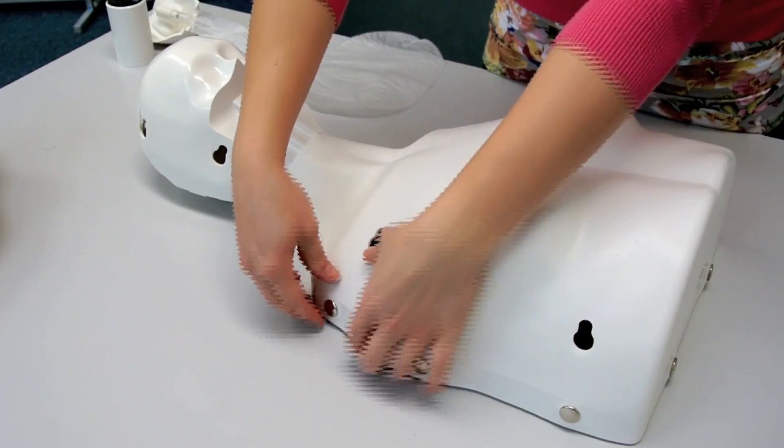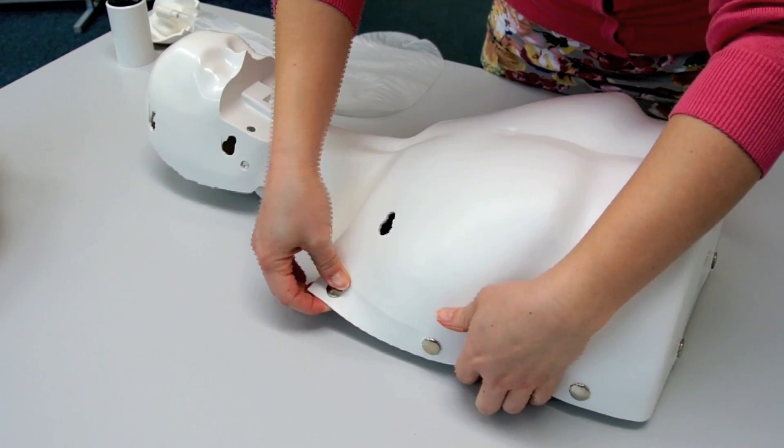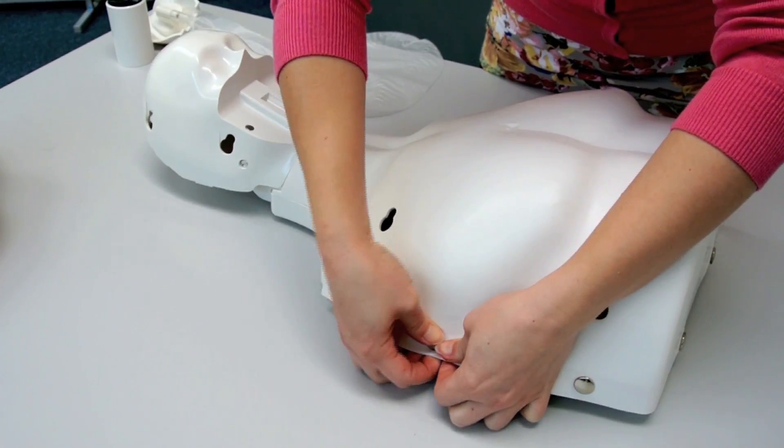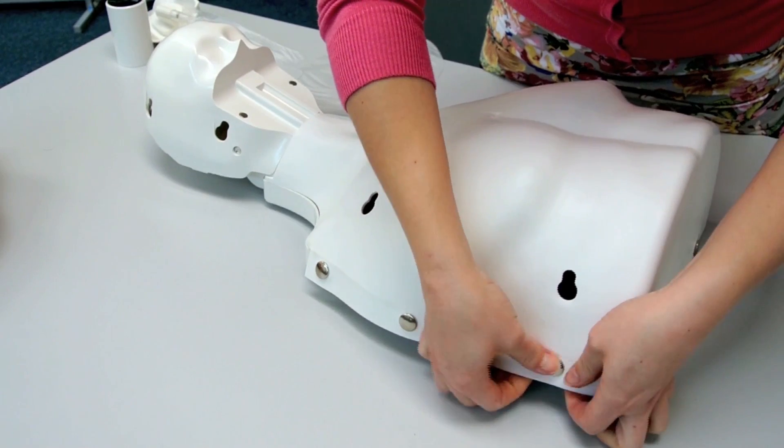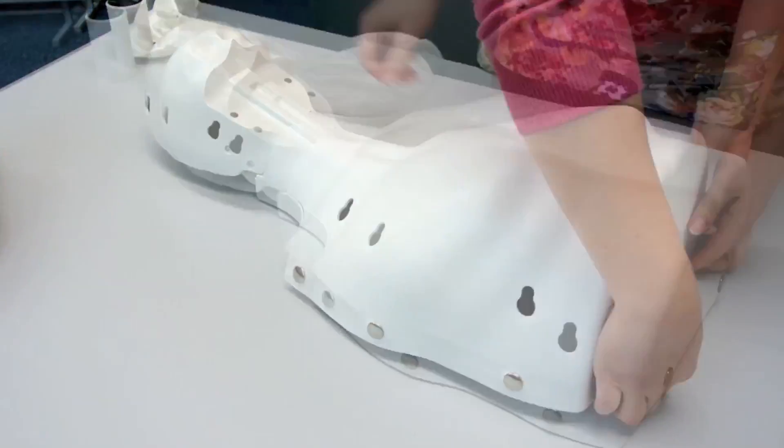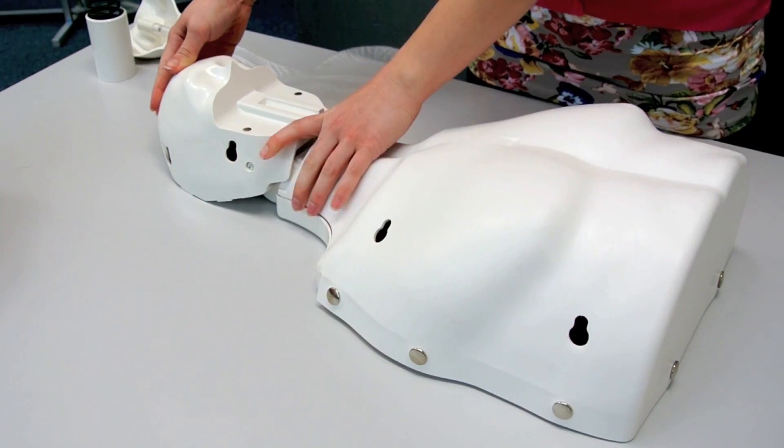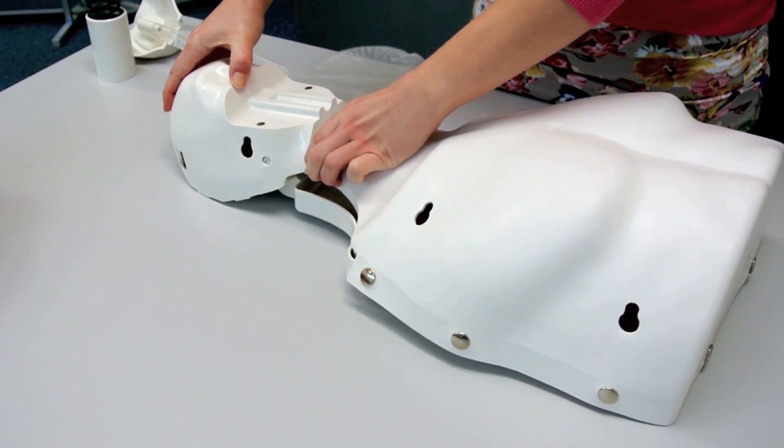Changing the compression spring allows for child mode. Once the thorax skin, face skin, and lung bag have been removed, the thorax cover can be detached and removed. Tilting the head back will make it easier to remove the thorax cover.